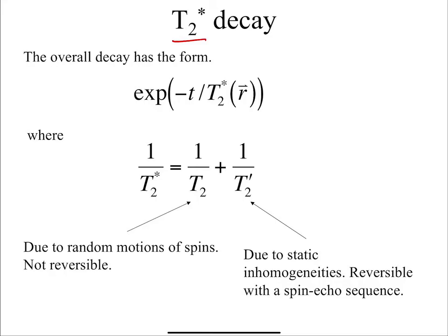Yeah, what people are doing is they're coming up with something called localized shim coils. To deal with these things, people have even put coils in their mouth to combat the field strength, or sometimes they put some graphite things, but that doesn't really work because no one wants stuff in their mouth. So people have come up with coils that you can put very close to your head, or many, many coils such that you can somehow compensate for the fields.